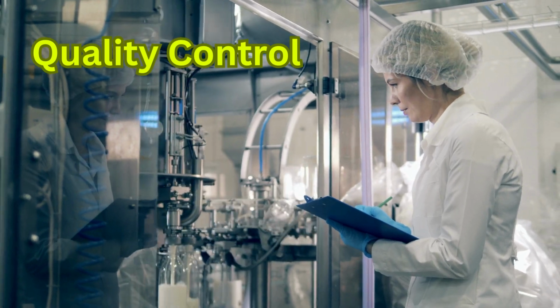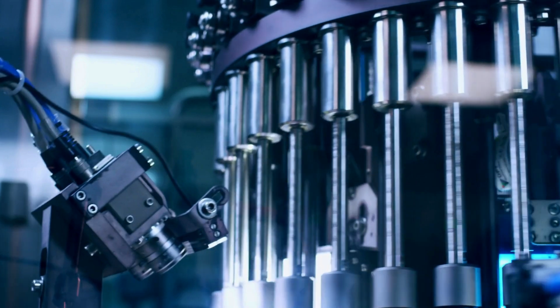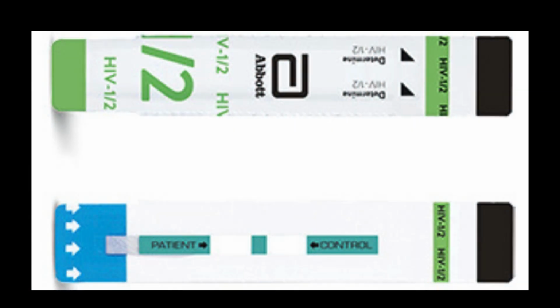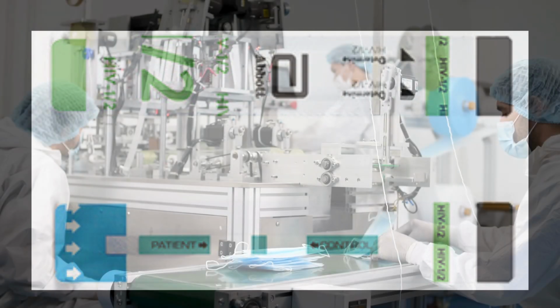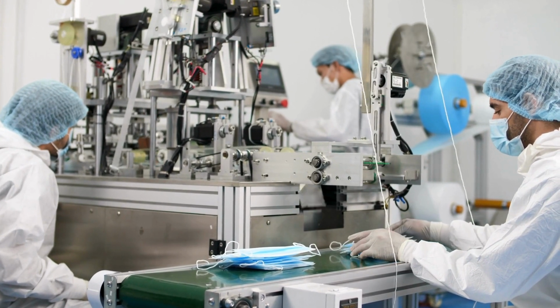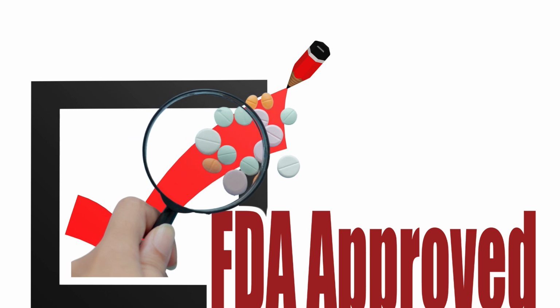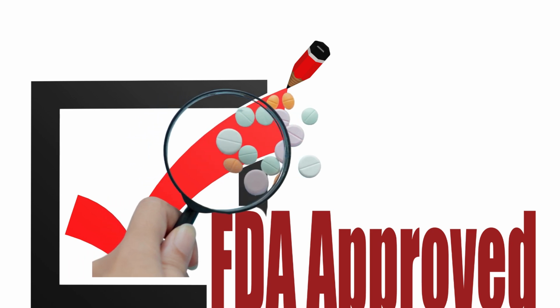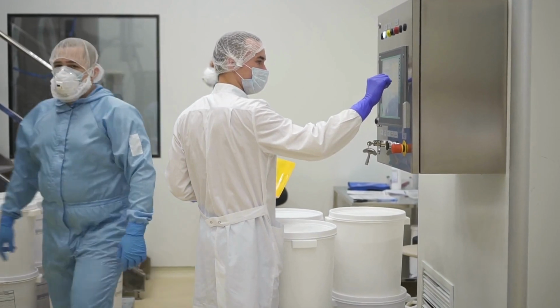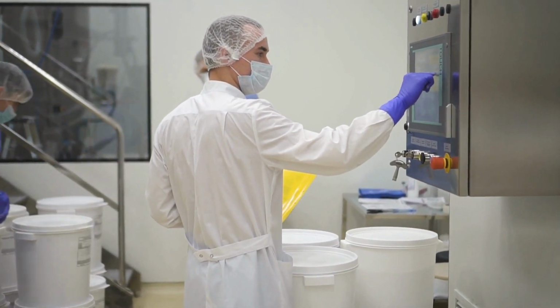Quality control. Manufacturers implement strict quality control measures to ensure test reliability. Each test includes a built-in control or the control line to verify proper test function. Regulatory oversight. HIV test strips are regulated as medical devices. In the United States, the FDA oversees their approval and quality standards. Similar regulatory bodies exist in other countries to ensure test accuracy and reliability.